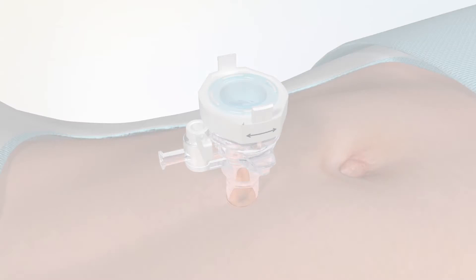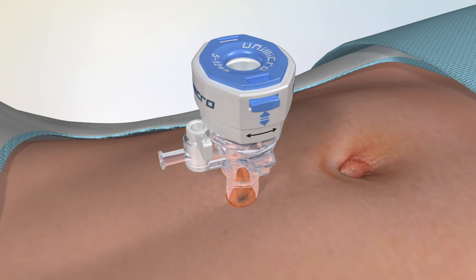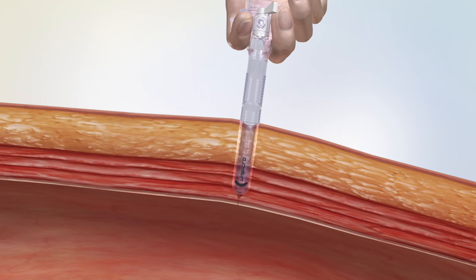Moreover, you can take off the handle by rotating to detach it rapidly, which also features a deep funneled entry for smooth instrument exchange.